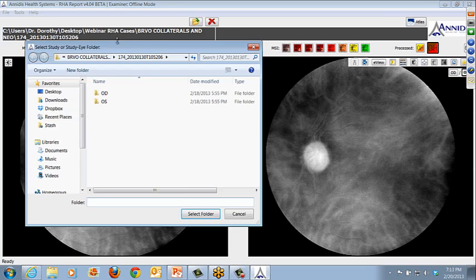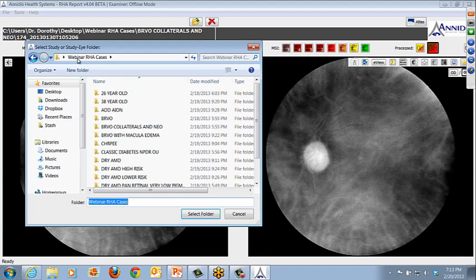You'll see that often. Dawn, I think you had a case like that in one of your presentations where there were some collaterals similar to this. I did, and it was very helpful to make that distinction, like you were talking about, with the collaterals versus whether or not they were leaking. She was about a year out after surgery, and did very well.